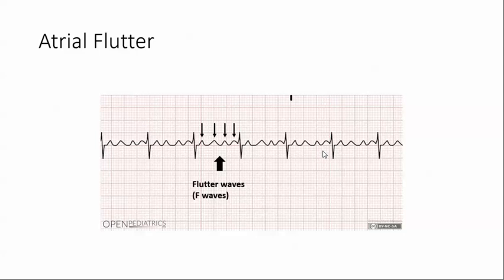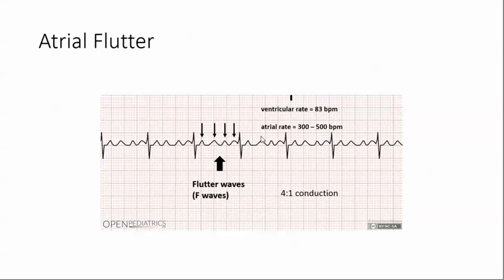The ventricular rate may be slow, normal, or fast. In this strip, we're in a 4 to 1 conduction. The ventricular rate is 83 beats per minute. Keep in mind this is not a 6-second strip, and the atrial rate in this one is between 300 and 500 beats per minute. So the atrial and ventricular rates are different, with the atrial rate being much faster.